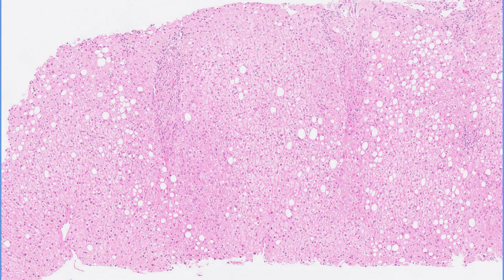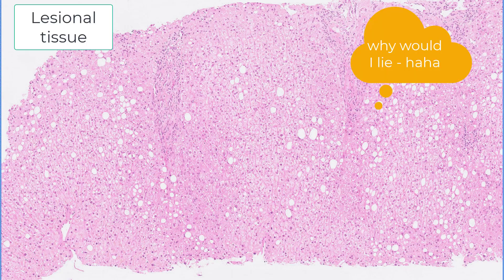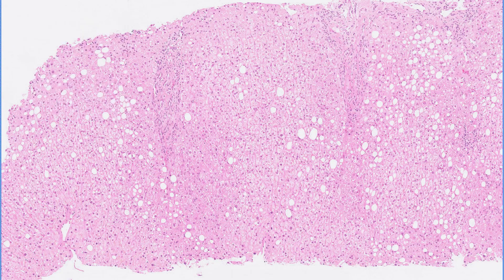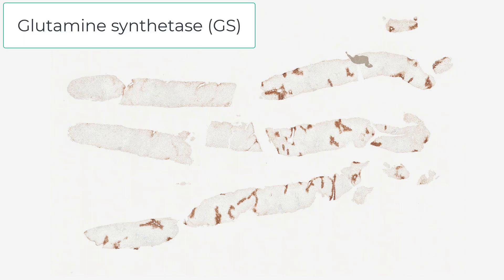I'm going to tell you this is lesional tissue. The first thing we're going to have to do is decide whether this is benign or malignant liver. There's a completely different talk that covers this — but take it from me, this is benign liver with a bit of fat.